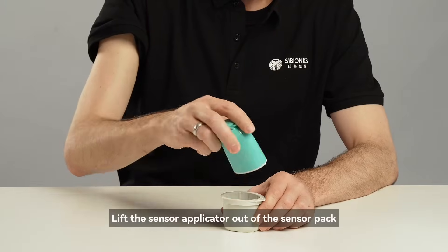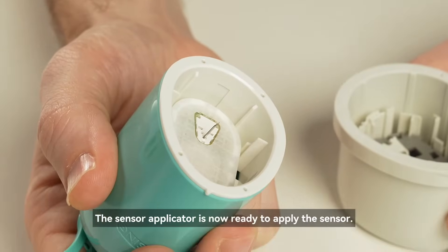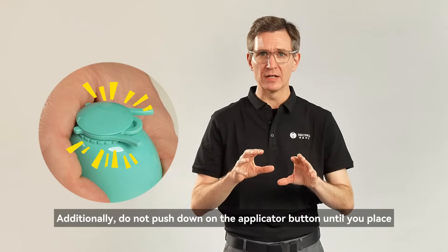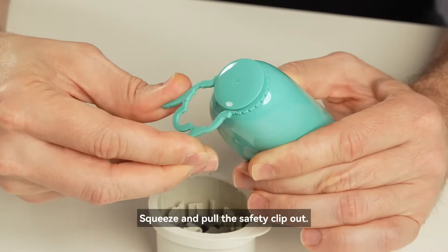Lift the sensor applicator out of the sensor pack. The sensor applicator is now ready to apply the sensor. Additionally, do not push down on the applicator button until you place it over the prepared site. Squeeze and pull the safety clip out.